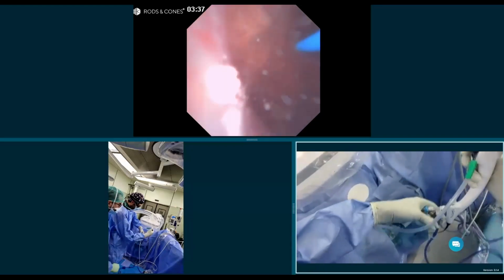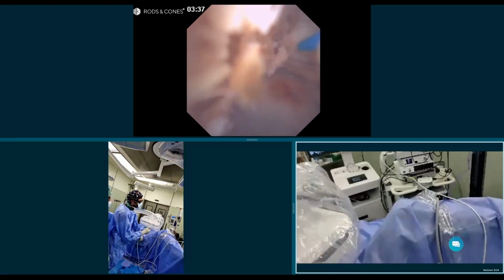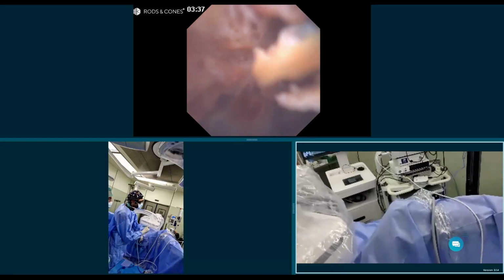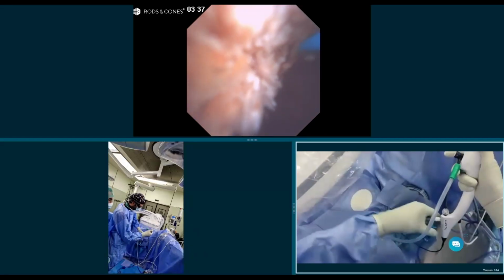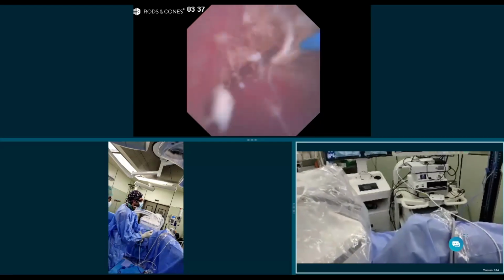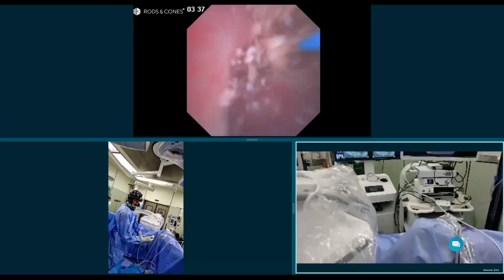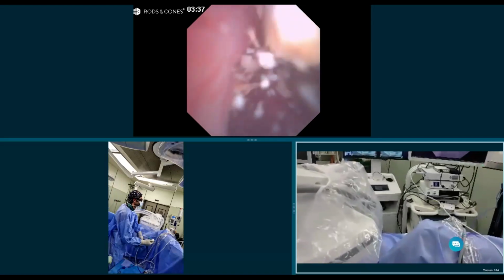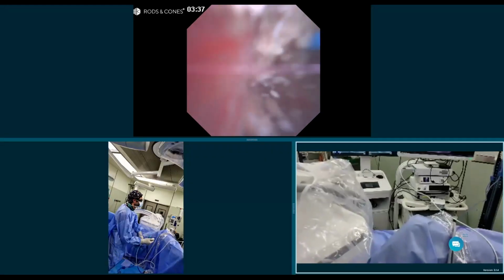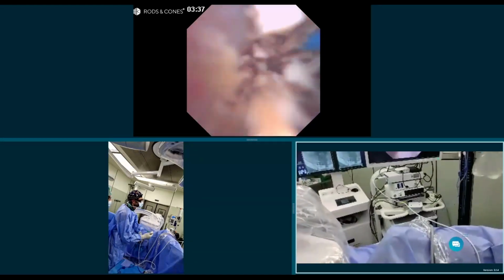I'm going to close the irrigation here, and I'm going to try to aspirate some of the debris. You can see what we may aspirate here, a little bit. Excellent. I'm a little bit of a perfectionist, so I want the patient to have only dust, real dust.